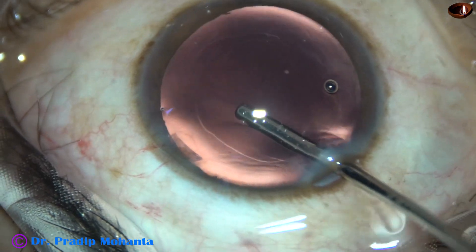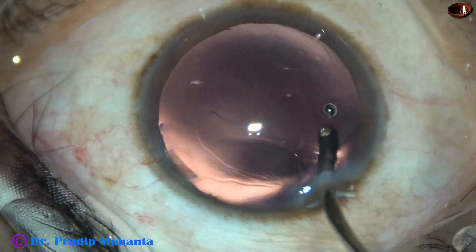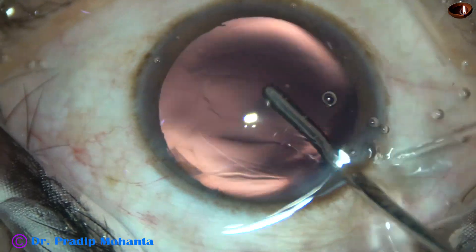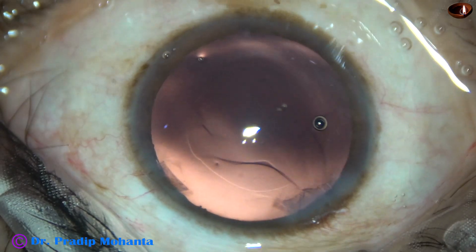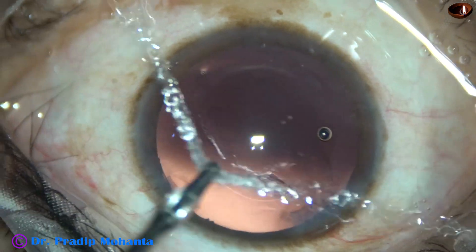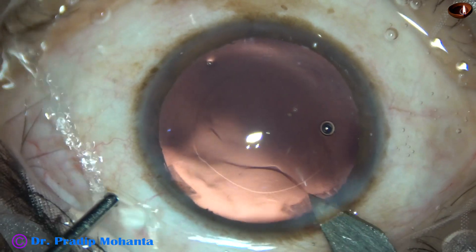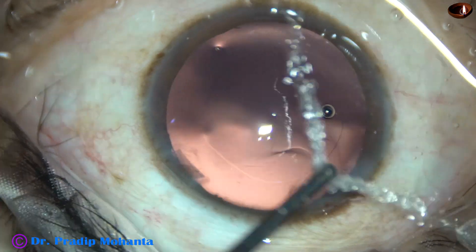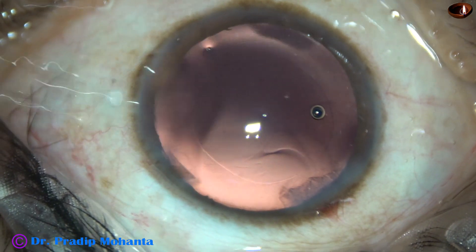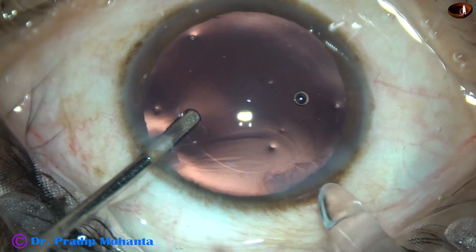This is a bit of polishing of the posterior capsule using only irrigation. The irrigating jet or fluid dislodges the cells. This is a small enlargement of the main wound because I am going to use a Whitestar cartridge.